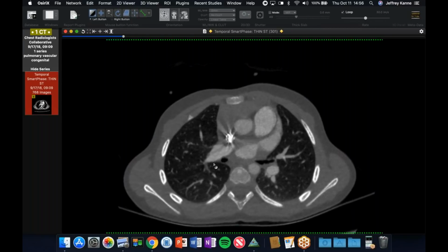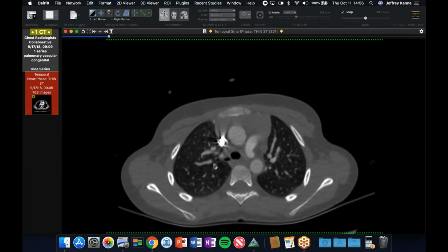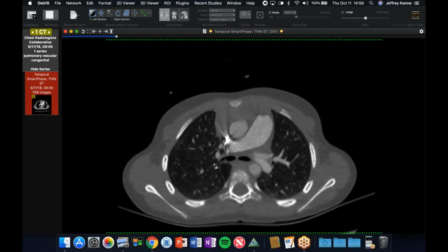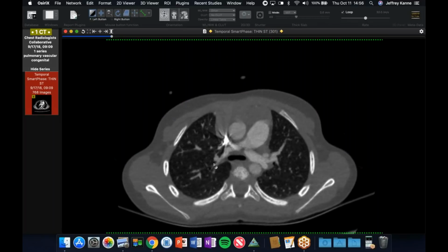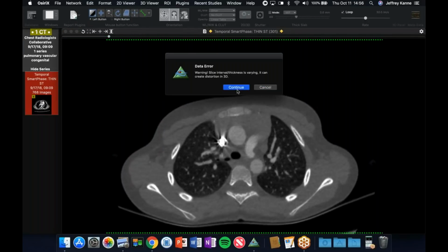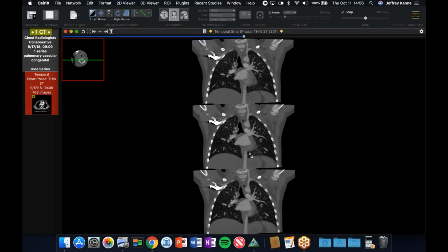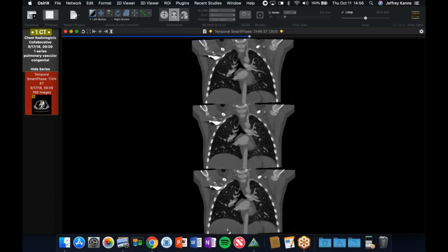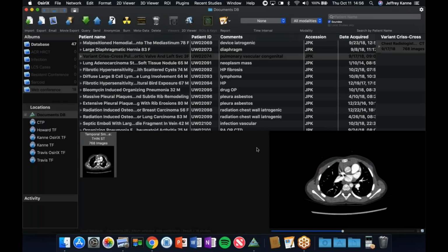Middle lobe, lower lobe, bronchus intermedius, and it looks like a single branch. Oh yeah, there it is, and there's the tracheal bronchus. So it indeed completes the rule. Yep. I hadn't even looked at the airways in this case because I was shown the arteries and got all excited about it and forgot to look at the airways. So there's the tracheal bronchus. Fun. Okay. Well, great cases, everyone.